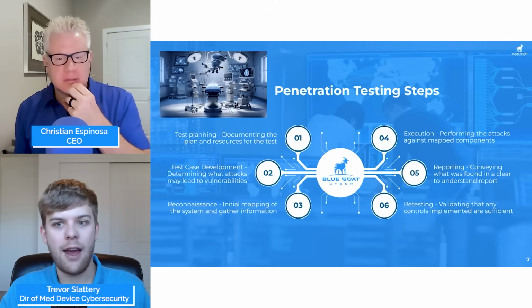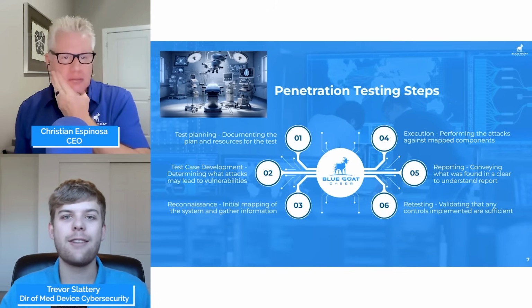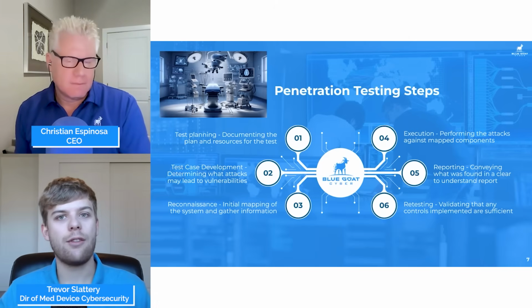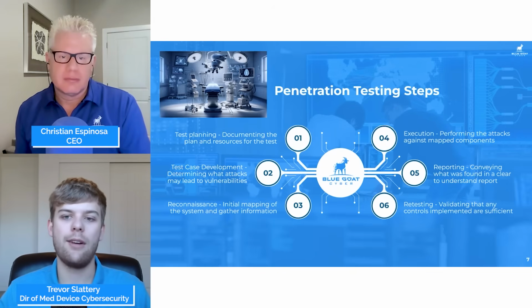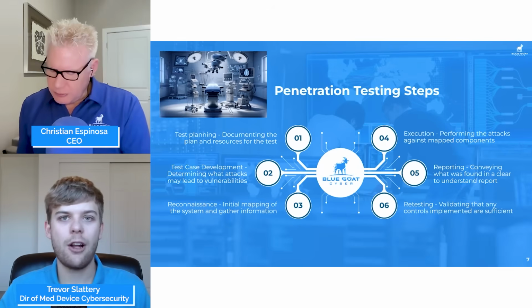So we talk about what we found, and it has to be in a very clear to understand report. It's often said that a penetration test is only as good as the report that is provided. Doesn't matter how much we can do as far as exploiting the system if we can't talk about how we did it and how to fix it. The remediation is the most important step here. So when we're generating this report, it should be in a very easy to follow manner.